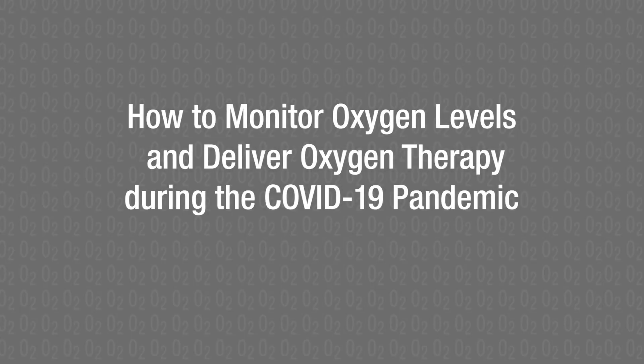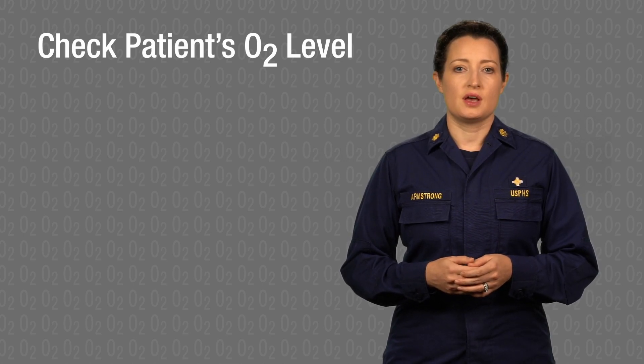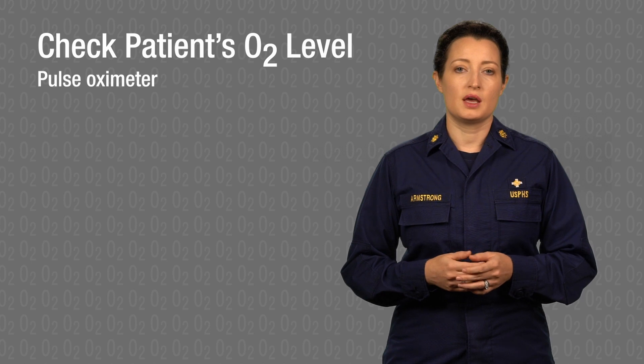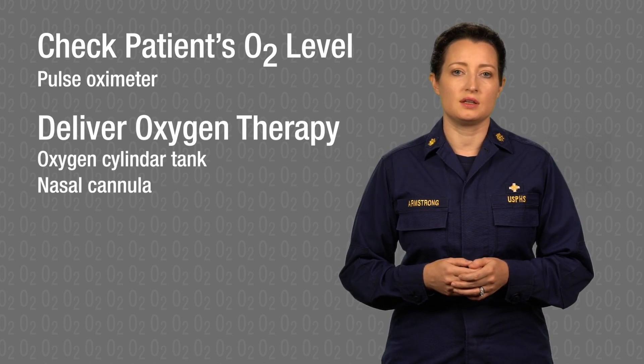How to monitor oxygen levels and deliver oxygen therapy. We're going to demonstrate how to check a patient's oxygen level using a pulse oximeter and deliver oxygen therapy using an oxygen cylinder tank and nasal cannula.